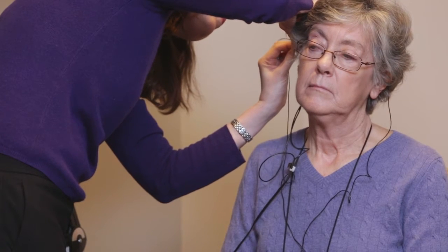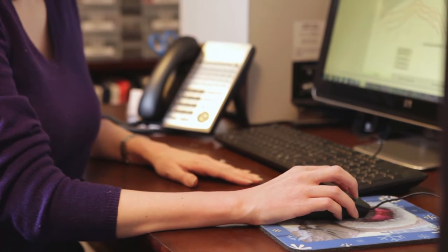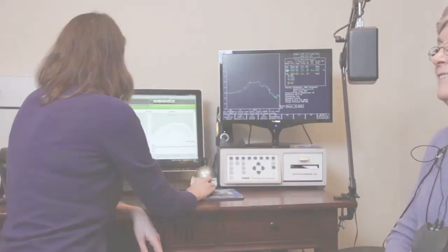If we do real ear measurements then we know that we're very close to what's going to sound good to the patient. We might adjust the hearing aid a little bit from there just based on the patient's experience in the real world, but it takes a lot of the guesswork out of the fine-tuning and we know that we're very close to where we should be.